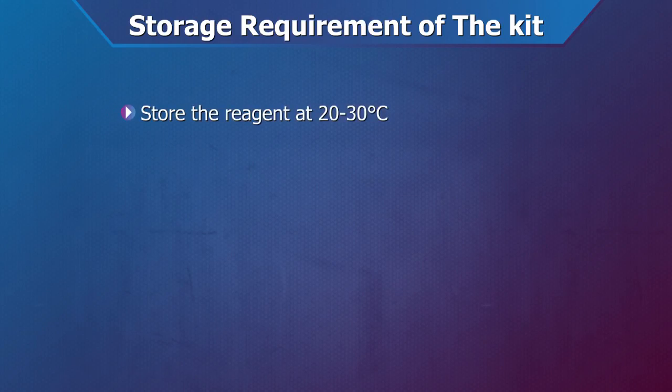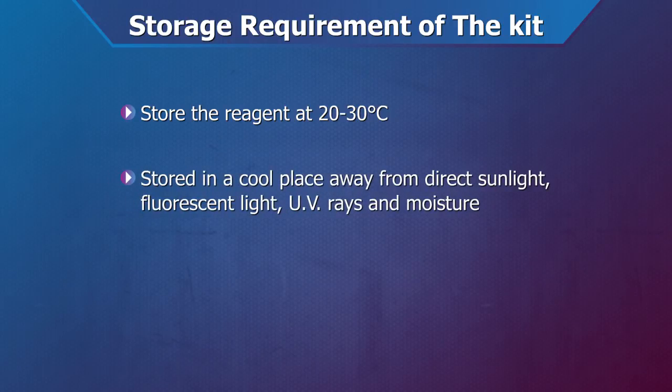Store the reagent at 20 to 30 degrees centigrade in a cool place away from direct sunlight, fluorescent light, ultraviolet rays, and moisture. Do not refrigerate. All contents are ready to use.